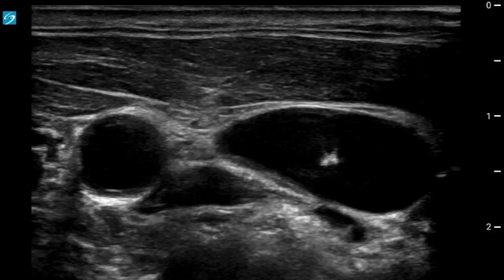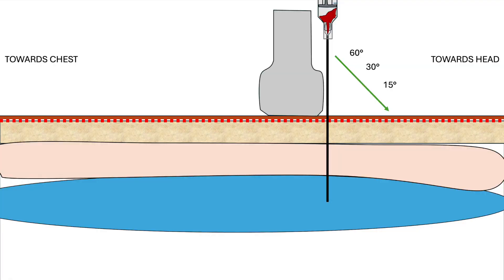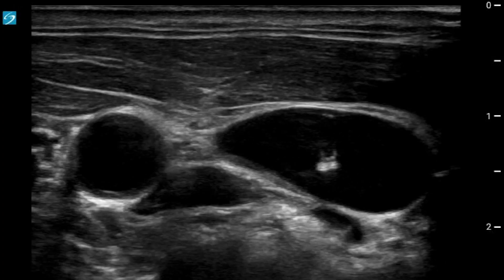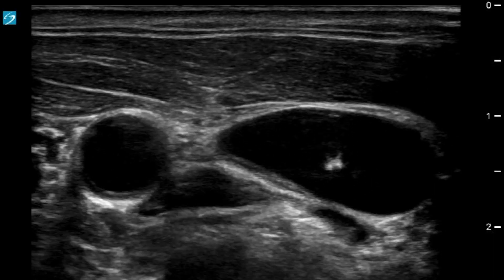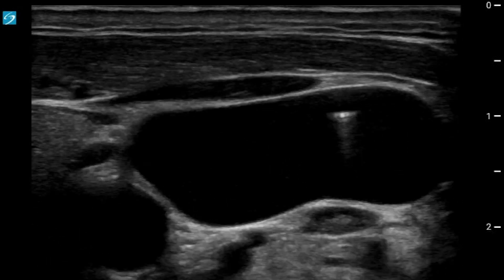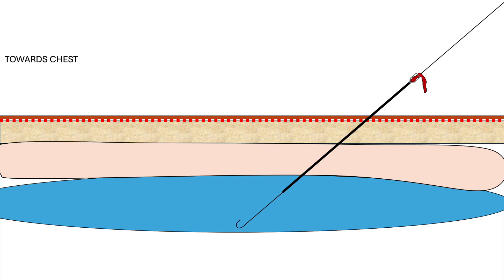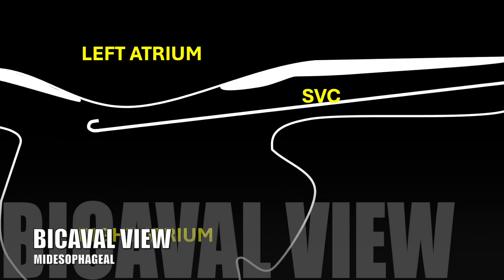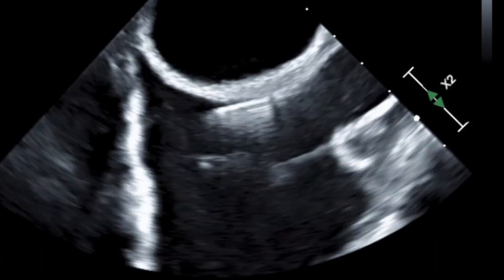I then gradually and carefully lower my angle under ultrasound guidance. Note that as I drop the needle angle, the bevel tip shifts centrally towards the chest and heart. So I fan my ultrasound probe centrally to see the bevel tip throughout, and I stop when I am as parallel to the vein as possible. I then disconnect the syringe from the needle and advance the J wire down the IJ into the superior vena cava and right atrium, and I see it in the mid-esophageal bicaval view on TEE.